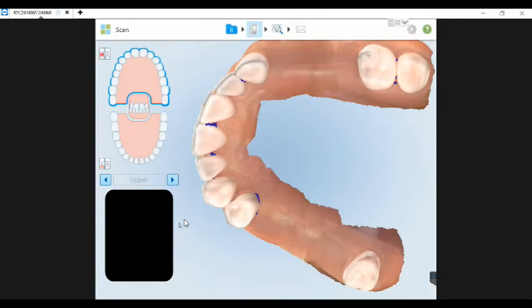One final question. Will you demo how to do a pickup impression with an existing partial for fabrication of a new crown? So like retrofitting, a new crown. I don't have a partial.